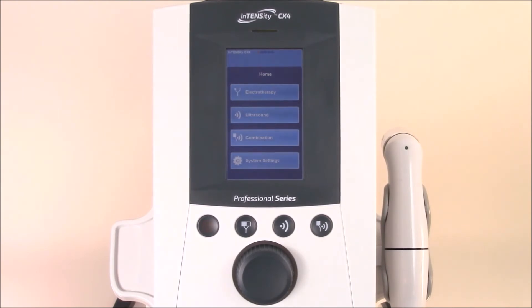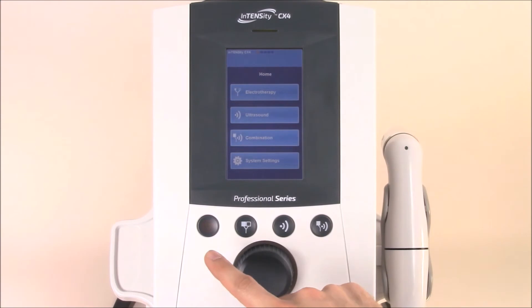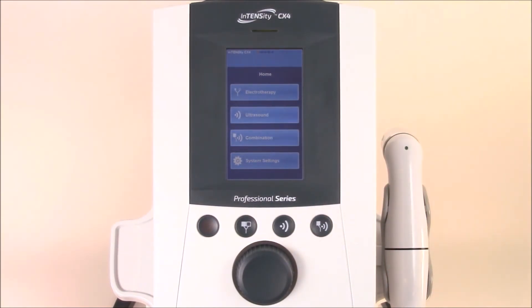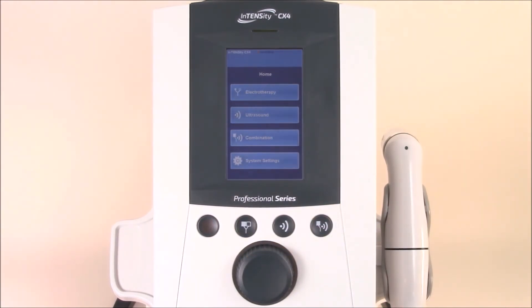Before we jump in and use the intuitive touch screen, let's look at the user quick access buttons below. Here you'll find the electrotherapy button, ultrasound button, and the electrotherapy and ultrasound combo button. You'll also find the stop button here. You can quickly access each of these by selecting the button.